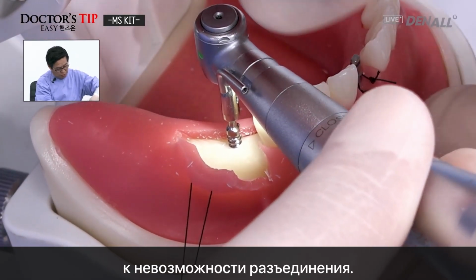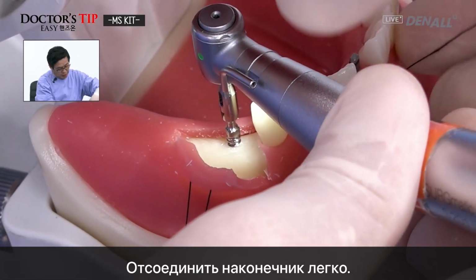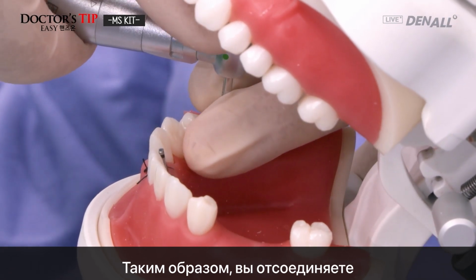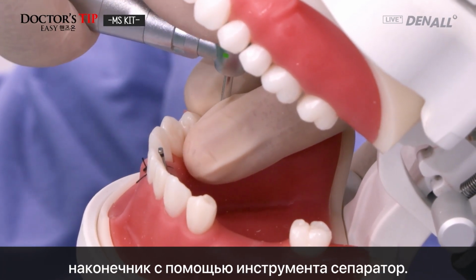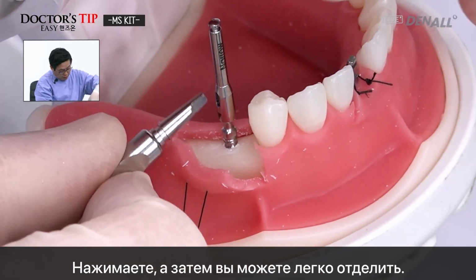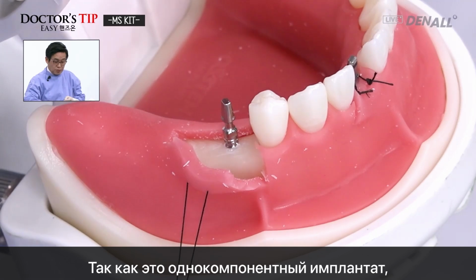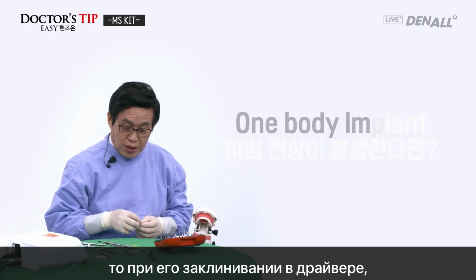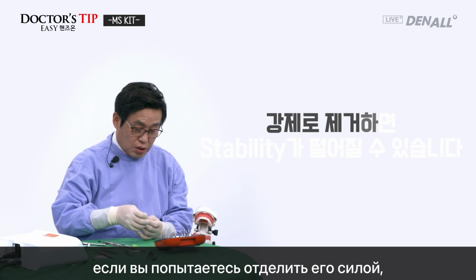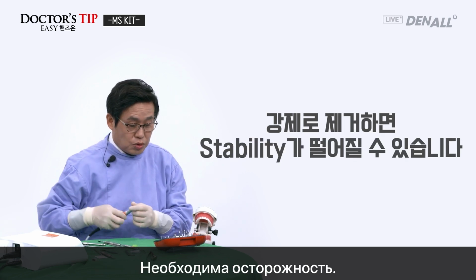And again, here also, excessive torque results in not being able to separate. Then removing the handpiece is easier. So you remove the handpiece using the separator, push it in, and then you can easily separate the two. Because it's a one body implant, if there's jamming and you force it out, you will lose stability. So you have to be careful.